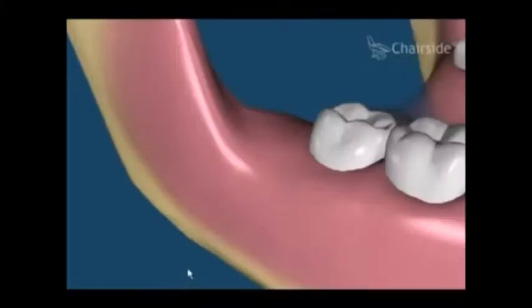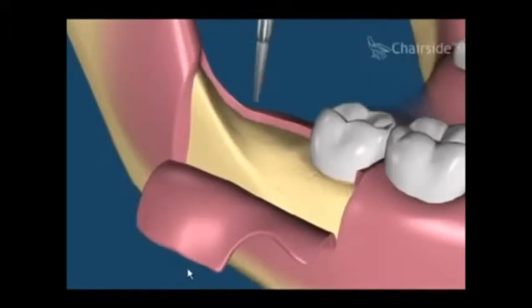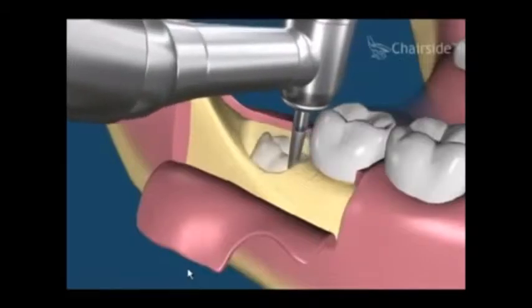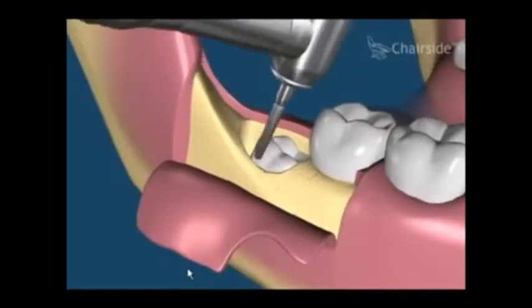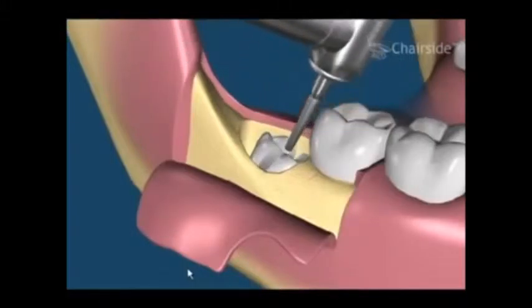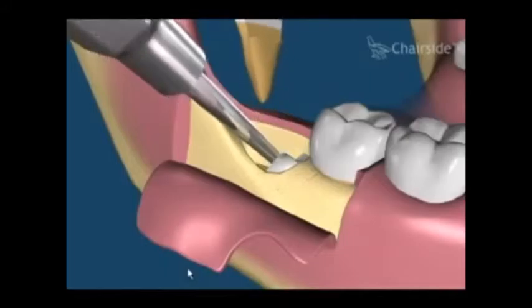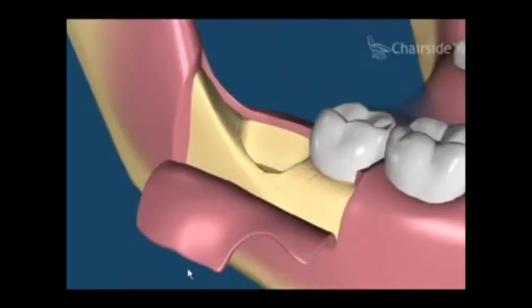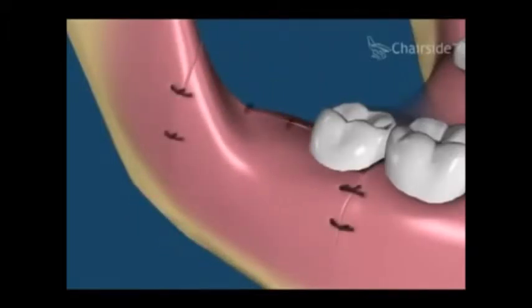This movie shows an impacted lower wisdom tooth. In a full bony removal situation, we first raise a flap. Since the tooth is completely covered with bone, significant bone is removed to gain access to the tooth. Then we section the tooth. The tooth sections can then be removed with elevators. A bone substitute can be placed in the socket to aid in healing. The flap is repositioned and sutured into place. The sutures dissolve and the area heals.